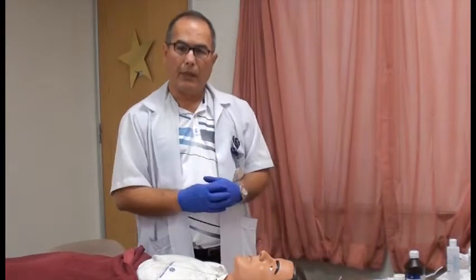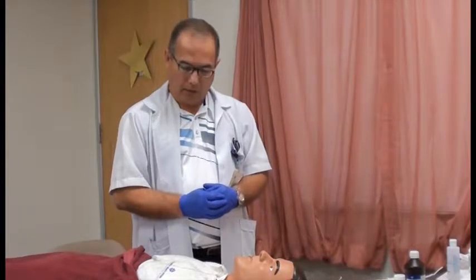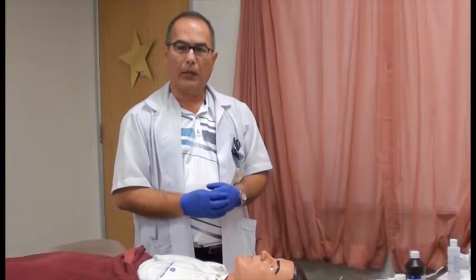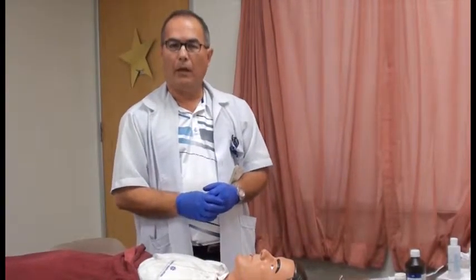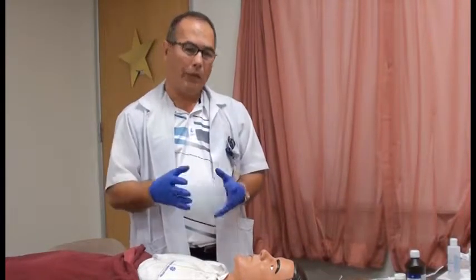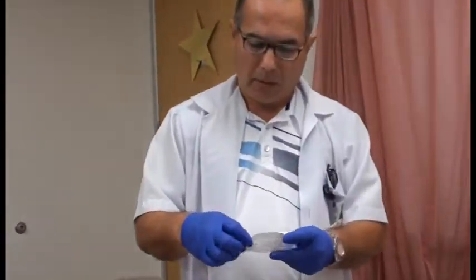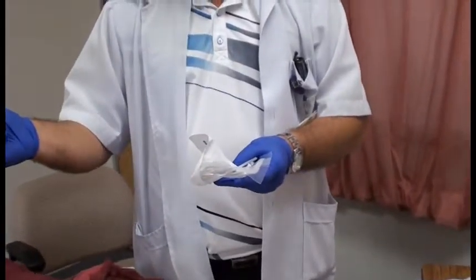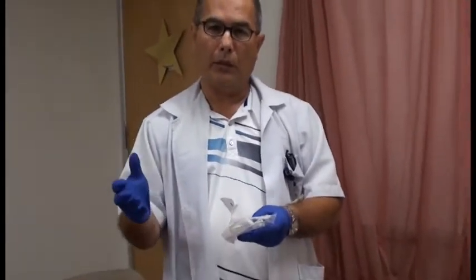So we're going to be assessing the patient first of all. We're going to make sure that their breathing is nice and comfortable, with no respiratory distress, and we're going to be listening to the breath sounds bilaterally, making sure that the patient is relatively clear. If there are a lot of coarse crackles and the patient needs suctioning, then we need to do that first. We have a suction catheter here, and we can just hook it up to the suction machine and suction the patient as we normally do.